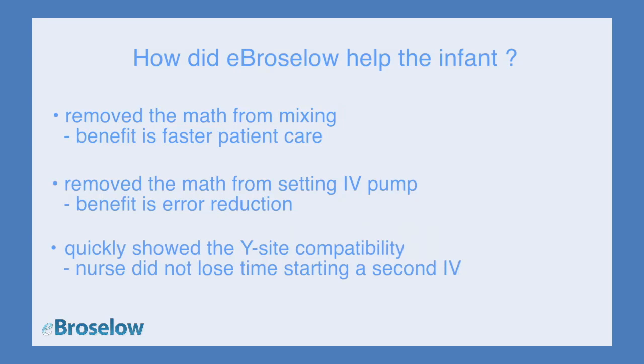And thirdly, the patient required a dopamine infusion, but a second IV line was not available. eBroselow quickly showed that dopamine is Y-site compatible with alprostadil, so the nurse did not lose time by starting a second IV line. These are just a few scenarios to demonstrate how eBroselow is improving patient safety and taking the math out of medicine.